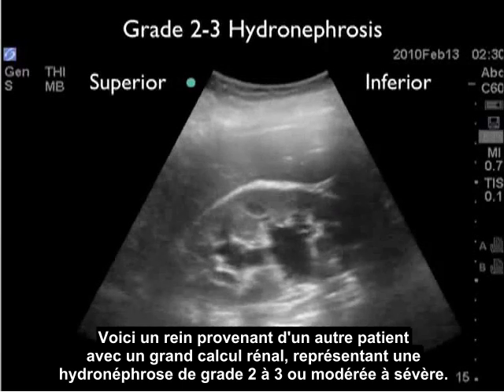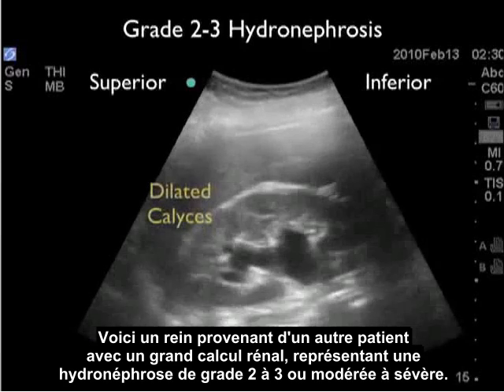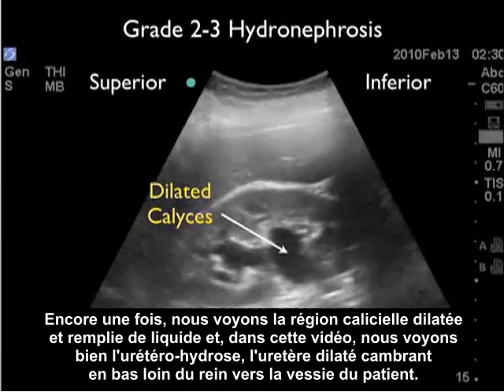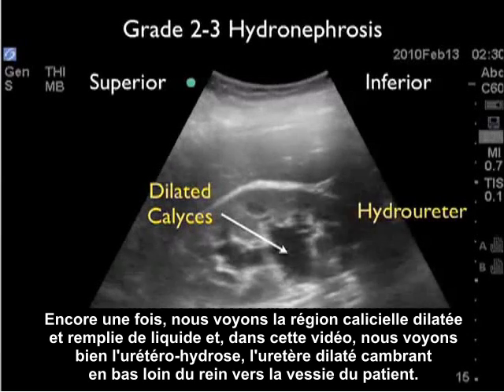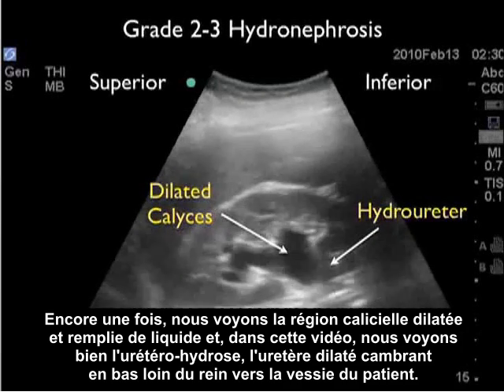Here's a kidney from another patient with a larger kidney stone representing a grade two to three, or moderate to severe hydronephrosis. Again, we see the dilated calyceal region filled with fluid. And in this video clip, we see the hydroureter, the dilated ureter, arching inferiorly away from the kidney down towards the patient's bladder.